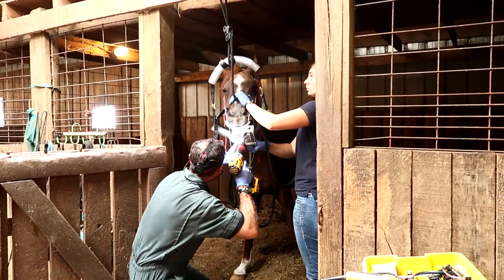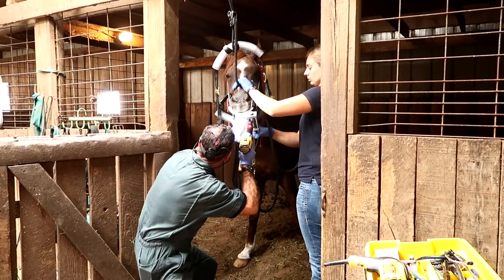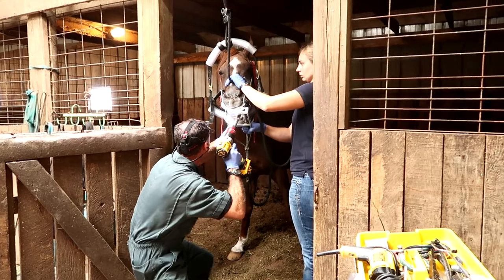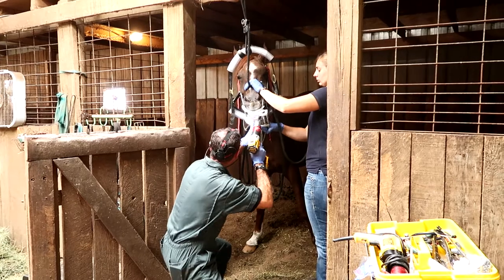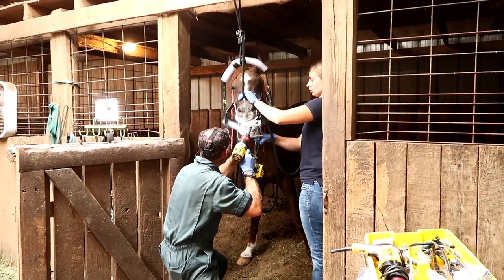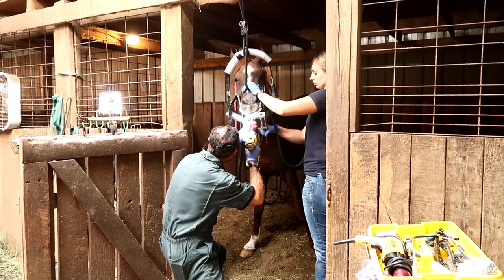If you've never seen this procedure done before, watching it kind of looks like it would be a painful procedure for your horse to go through, but it's not — it's completely painless for the horse. And especially with the sedative on board, that just helps them to not be quite so anxious.